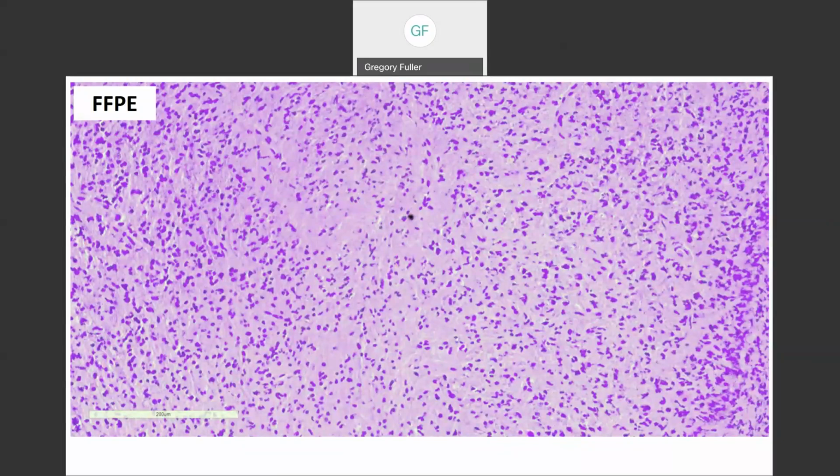And it is very common, if you're a neophyte, if you're green, you get a case in from the outside, you pick up what looks like a nice FFPE section, you see all these irregular nuclei, maybe you don't see the ice crystal artifact because it's a really good frozen prepared by a really good frozen section lab and histotech, and you don't appreciate that it's frozen, you could go down the tubes. So you have to be careful, all right?